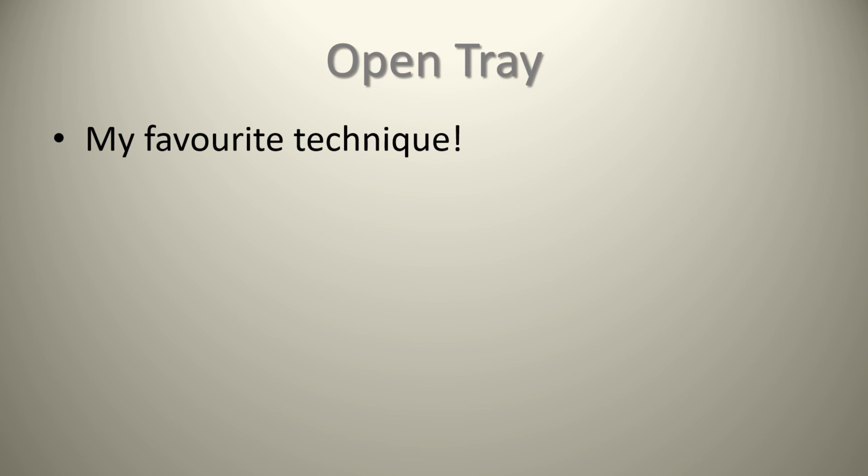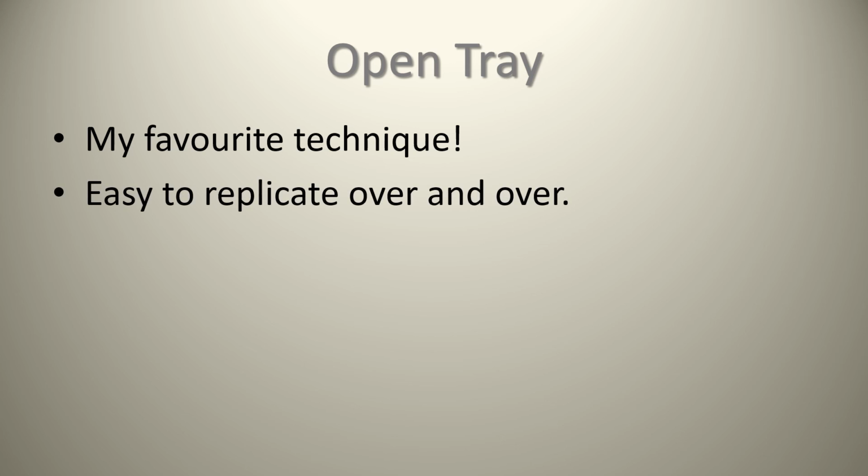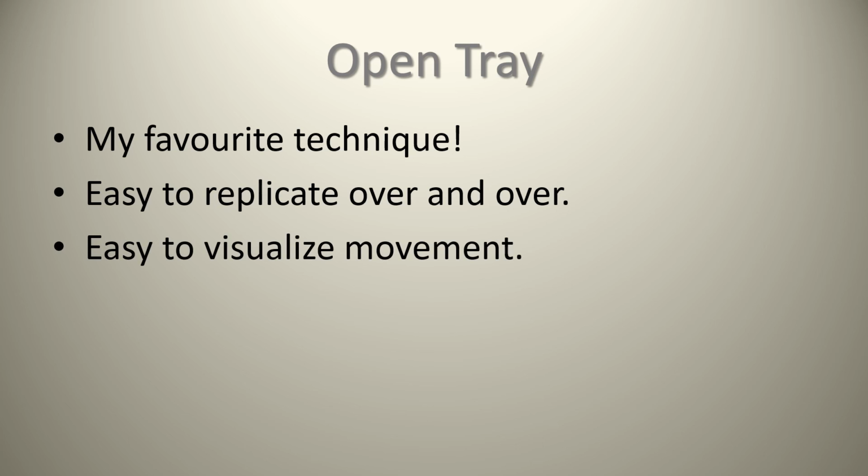So as I state in point number 2, it's easy to replicate over and over and over again. So it's basically, for me, that 3-pointer. It's that spot on the hard court that I'm able to consistently hit that shot over and over and over again. It's easy to visualize movement. And what I mean by this is if the patient moves in an awkward manner, or they bite down or something, it's easy to see where the impression coping has moved inside the mouth. It's not like one of those little plastic pieces that's just sitting on an impression coping or an abutment inside the patient's mouth, where when it moves, you don't quite know where it moved inside the impression material. So in this case, it's easy to visualize movement as well.